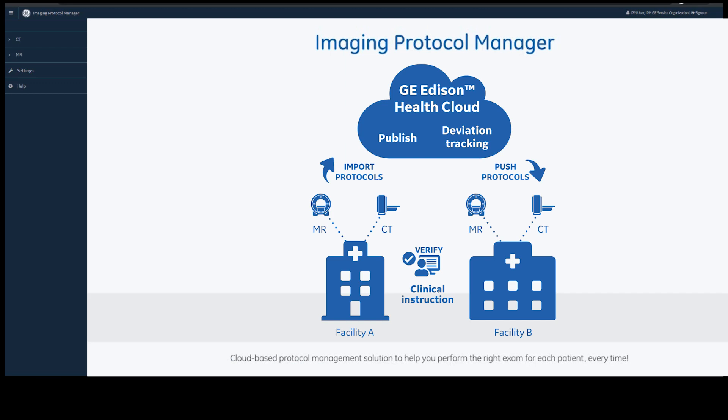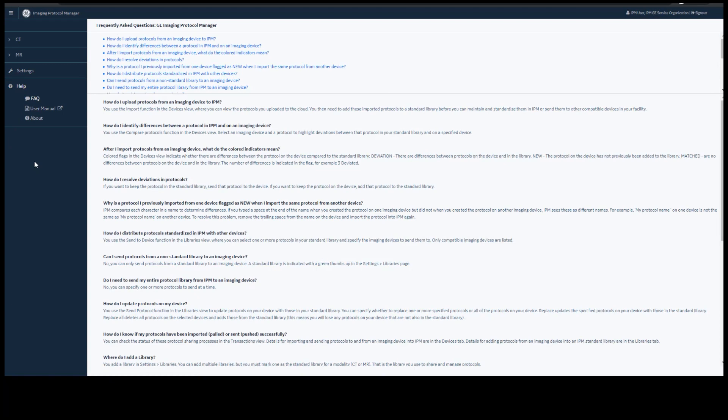As you can see, after logging into IPM on the left-hand side, you have CT, MR, settings, and help. Underneath the help, you have FAQs, a web-based user manual, and an about section.